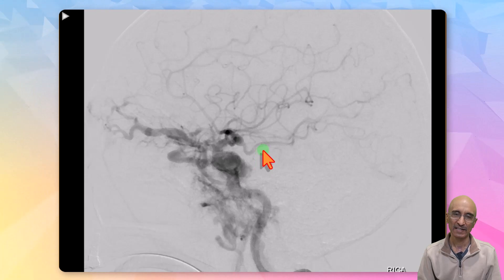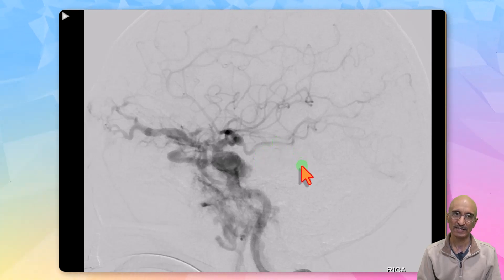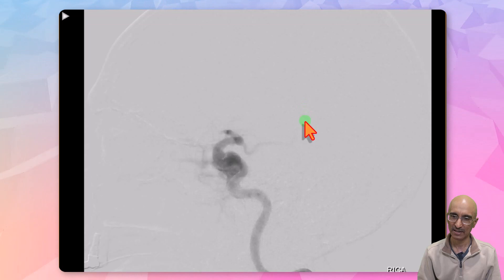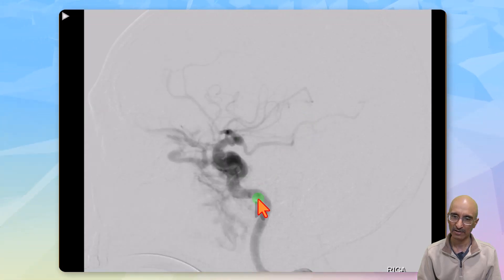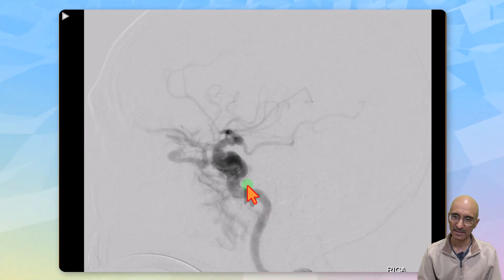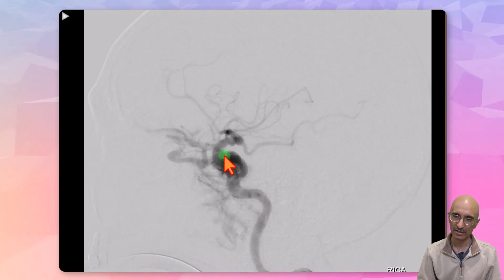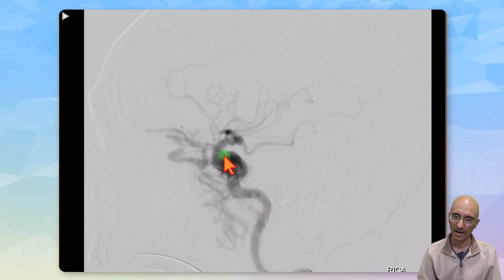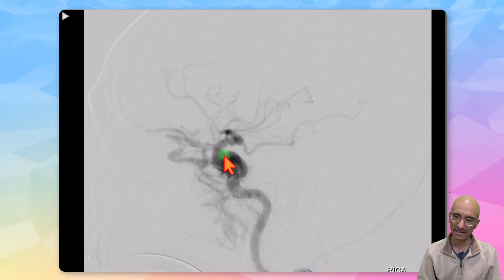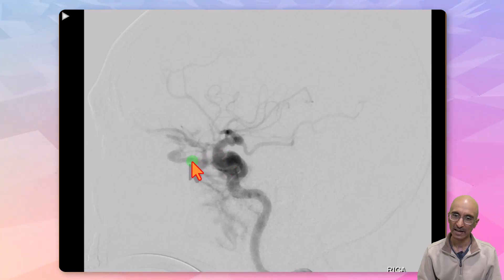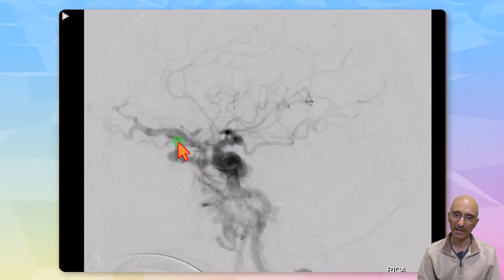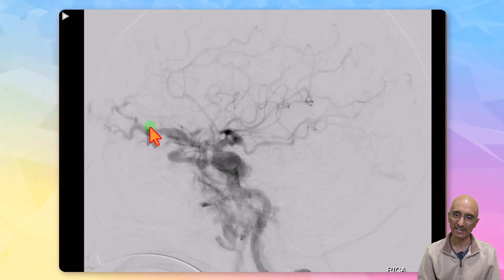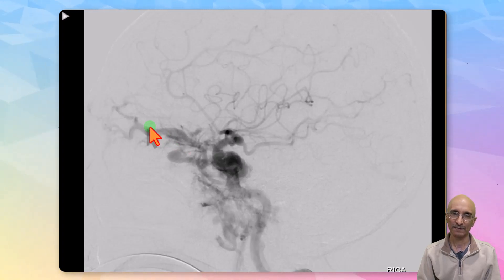The patient underwent a digital subtraction catheter angiogram examination. On the DSA examination, as contrast is injected into the right internal carotid artery, we can see the petrous and cavernous segments of the internal carotid artery. There appears to be a small aneurysm in the cavernous segment of the ICA, and we can see early retrograde filling of the right superior ophthalmic vein, which is markedly dilated. The DSA examination confirms a direct carotid cavernous fistula.